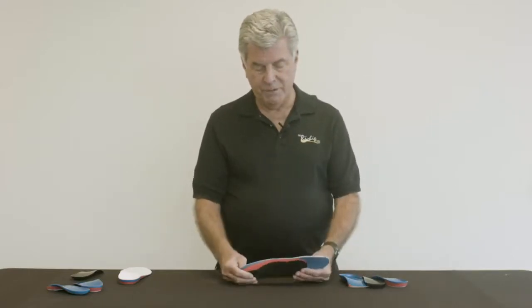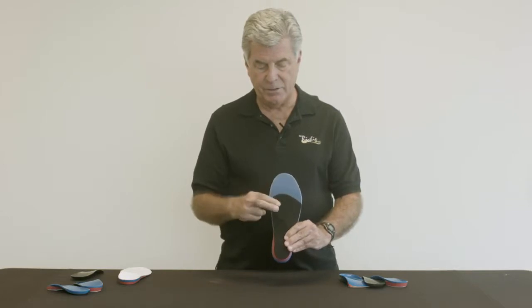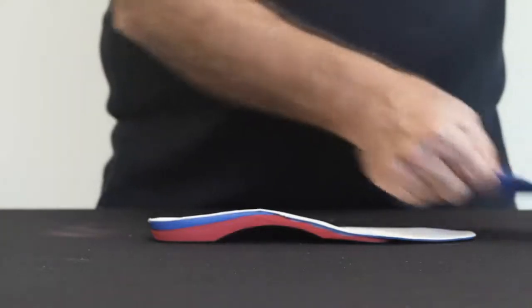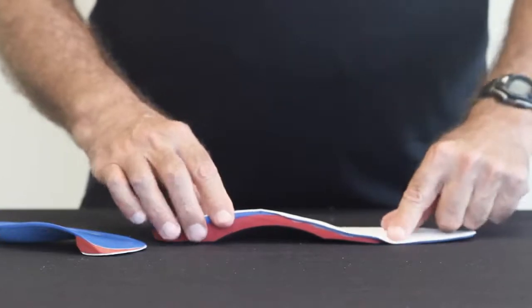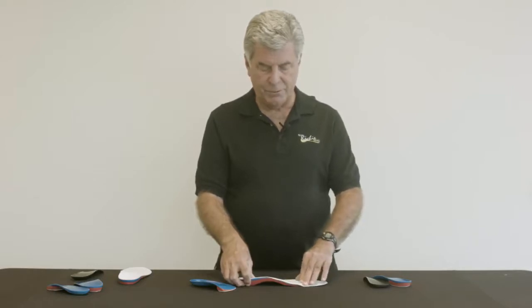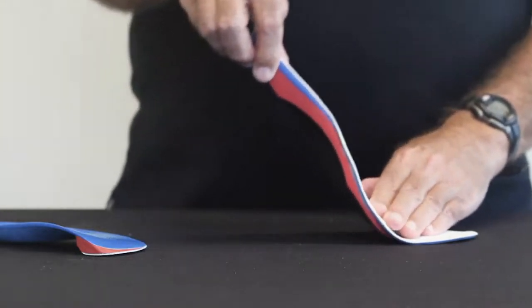Another form of posting is the extended sulcus wedge. This is an extended, usually crepe material or softer material, that's embedded on the bottom of the orthosis, and instead of ending at the anterior margin, the wedge effect is carried out to the sulcus. The advantage of this extended forefoot post, also known as a sulcus wedge, is that it carries the correction distally in the foot, so that we get control of the patient's foot during the propulsive phase of gait.